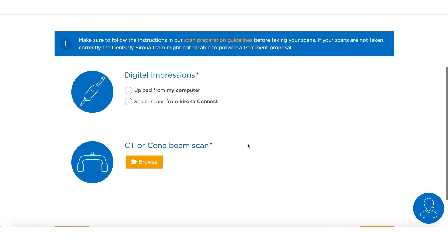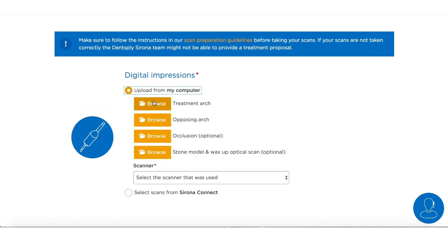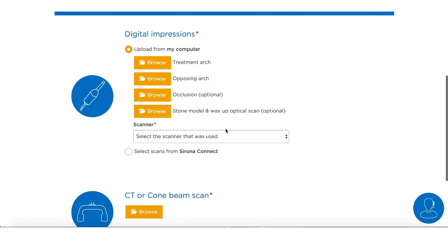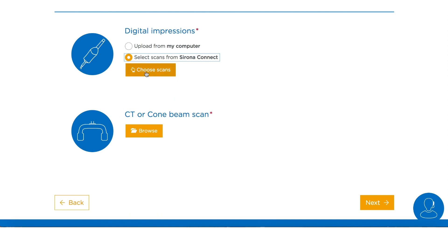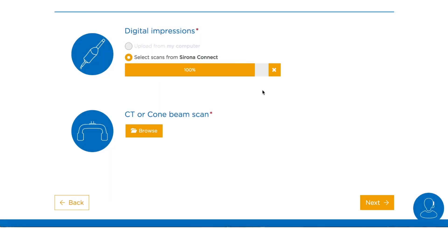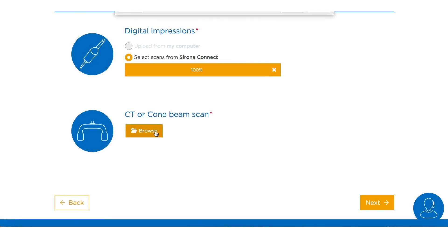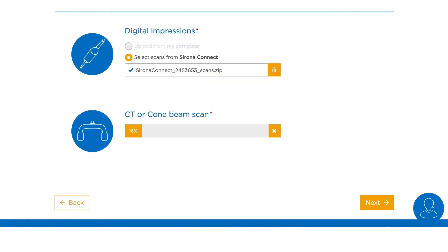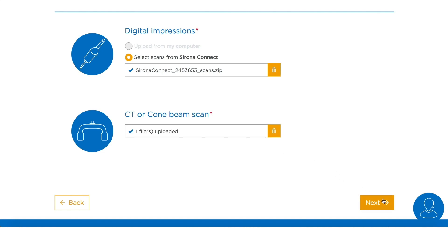Once you click Next, you'll have the option to upload the data collected from your patient. If you do an upload of an STL file, you can save it to your computer, click on the STL file and start to upload it. If you've sent your optical scan through CEREC Connect, you'll choose Select Scan, find your patient, and click Attach — once you hit Attach it will automatically upload. For the CT scan, we'll choose Browse, find where we saved our DICOM file. We can either use the DICOM RM zip or the CT1 zip; if we've converted and zipped the CT1, the upload speed will be somewhat faster, whereas the DICOM RM zip will take a little bit longer.